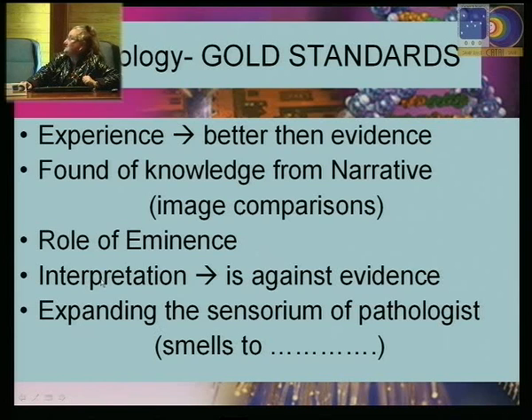This is based on interpretation, which obviously has nothing to do with evidence. You just interpret things the way you think they should be interpreted according to your experience and the images you have seen previously. And you have a sixth sense, or sexto sentido in castellano: when you see something, this smells to me like a neoplasia. And probably your first impression is the right one.